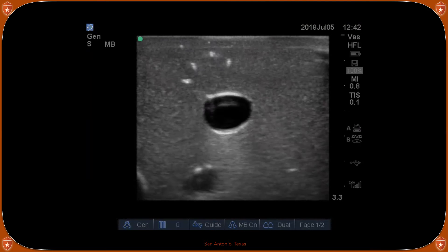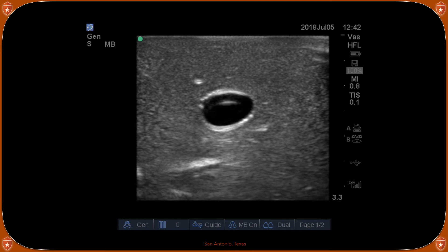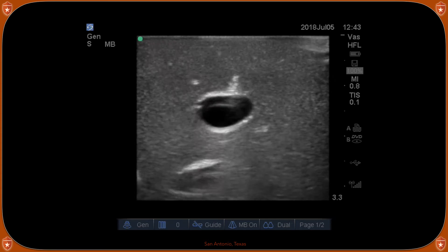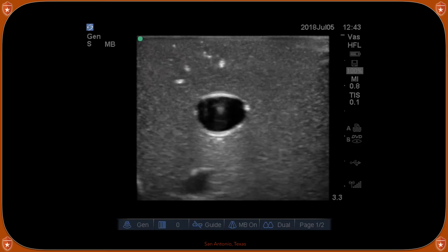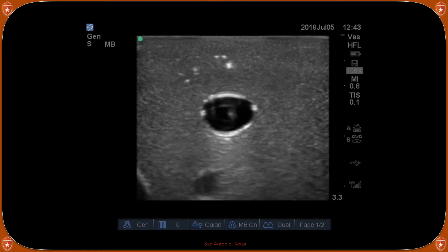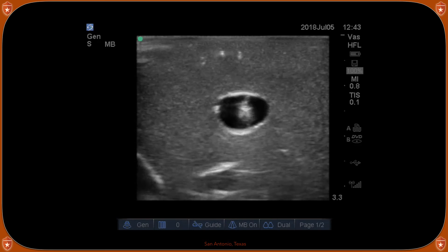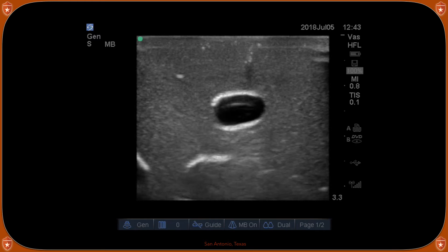Here's a video example of short axis view of a vein. A needle is inserted and you can see the needle tip inside the lumen. Scanning up and down, you can see the needle tip — a very bright shiny star — and then lose it as you pass it. Scanning back toward the shaft, the shaft also looks hyperechoic and could trick you into thinking it's the needle tip. The goal with the transverse view is to always visualize the needle tip. Do not advance the needle if you cannot identify the needle tip.